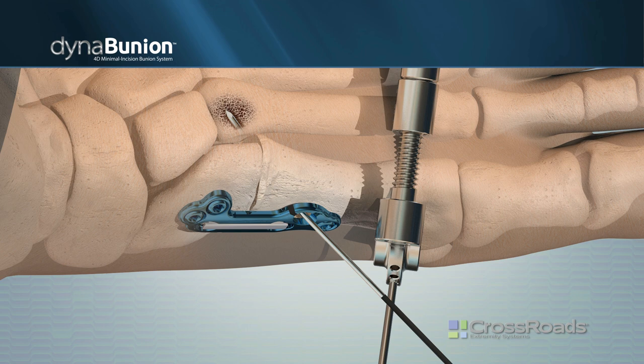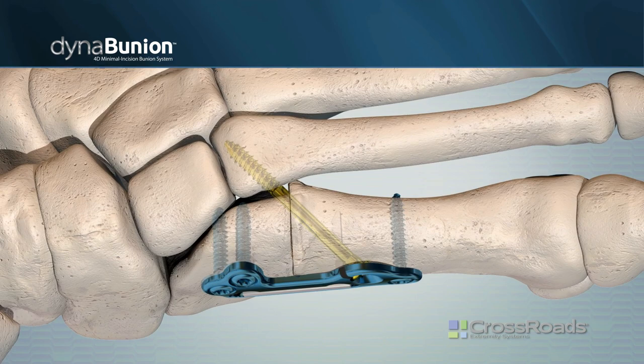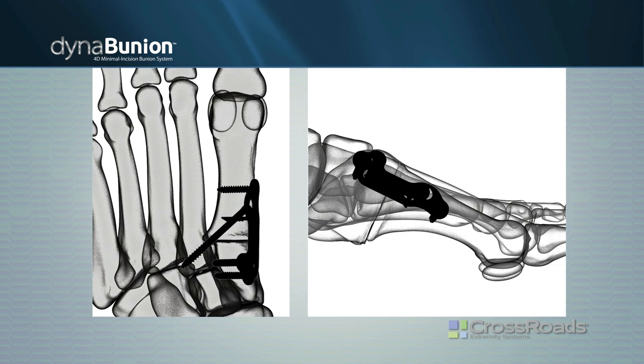Remove the depth wire and attach the selected anti-drift bolt to the provided driver and place it through the plate and into the prepared hole. Verify the final construct placement with fluoroscopy.